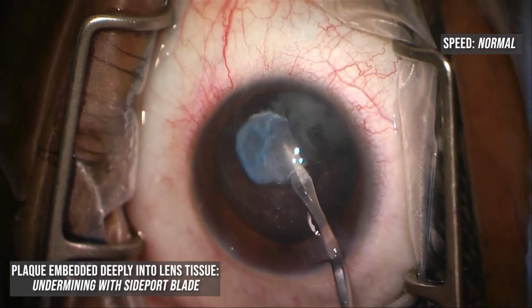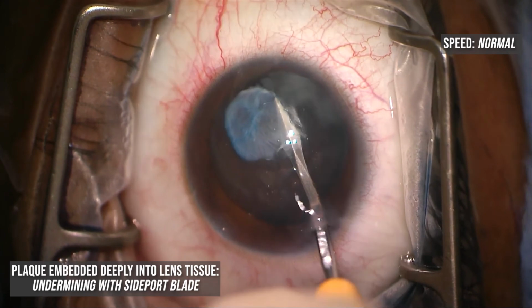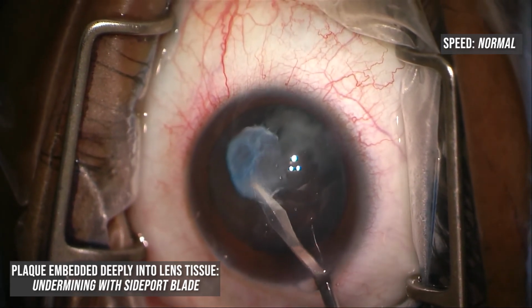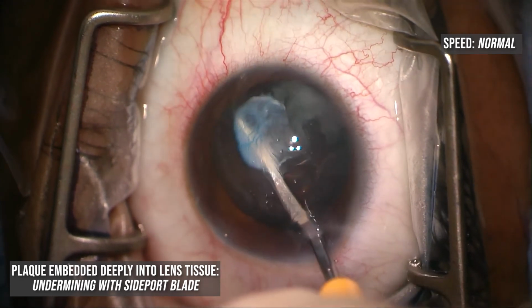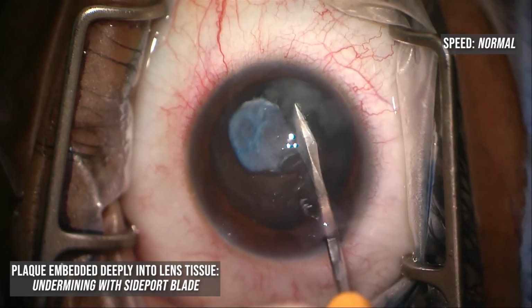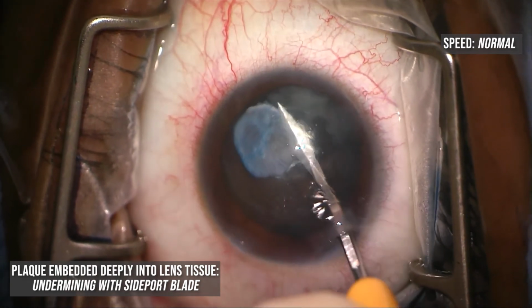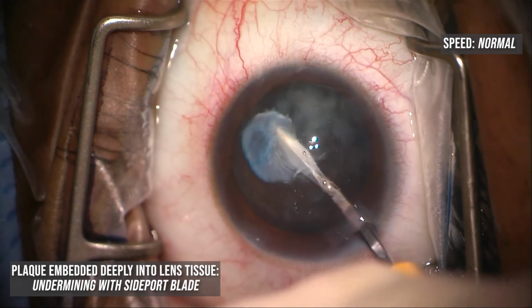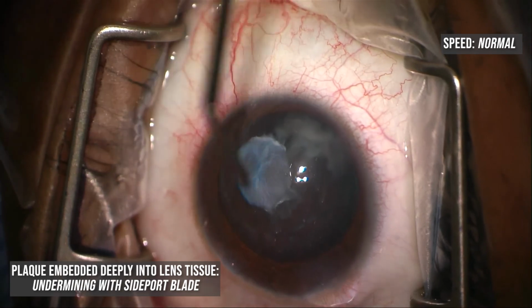Now, I've slowed it back down here, and because the plaque is so invested into the density of the lens, I'm actually cutting free the capsular plaque and the opacified membrane, which is underneath it, that is sort of mushrooming down into the nuclear material here. This is a step I'd never done before on a case until this one, but because the fragment would not come out easily, I went ahead and dissected underneath it with this dual side port blade.